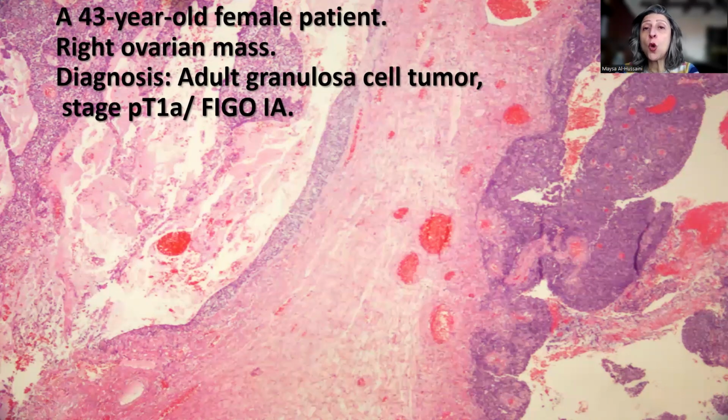Remember that you have to think almost always of a granulosa cell tumor, especially in perimenopausal females with ovarian masses, because this is the typical age for the presentation. Remember that granulosa cell tumor can have a variety of growth patterns, and although the classical morphology and classical teaching is a tumor with grooved nuclei and Call-Exner bodies, sometimes you don't find these findings, which are considered to be characteristic, especially if the tumor undergoes luteinization. Then those morphological clues will be lost completely.